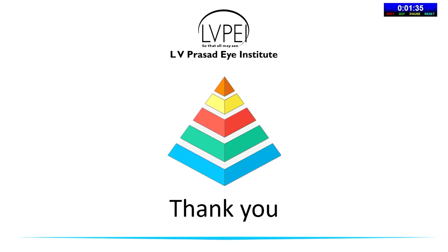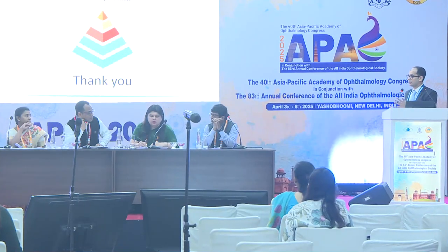What type of OCT is generally recommended in such type of cases? Sorry? What type of OCT? There is a different type of OCT. Swept source OCT will be best because it has the maximum depth penetration and gives us almost the extent of the lesion.